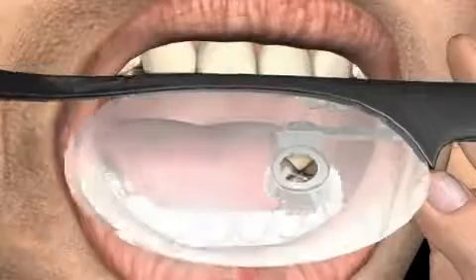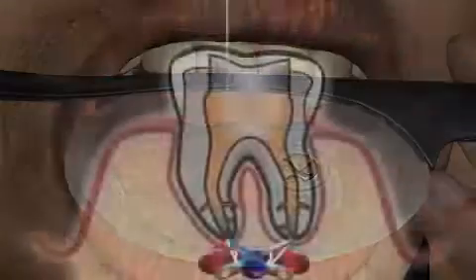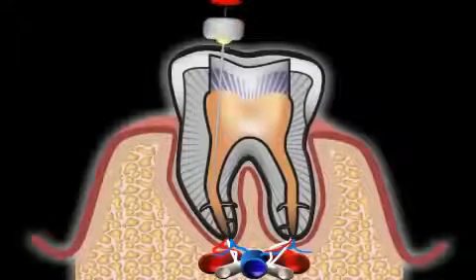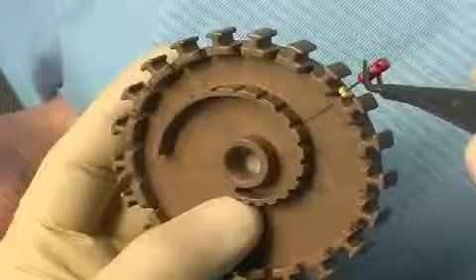The dental canal must be fully reconditioned all the way to the root end. The length of the root is ascertained by means of X-rays and measuring aids, as can be seen in this image. Only a well-reconditioned tooth, filled all the way down to the root end, can be preserved permanently.